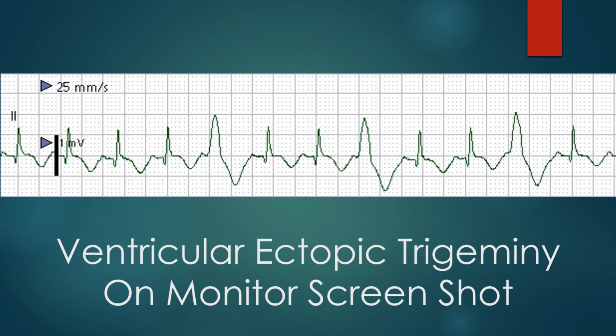Ventricular premature complexes are identified as being premature. In this case, the VPCs are not so premature, with the coupling interval from the previous sinus beat being about 400 milliseconds and that from the VPC to the subsequent sinus beat being about 560 milliseconds. Each ventricular ectopic beat is followed by a fully compensatory pause. In this case, the pauses are not very prominent because the usual heart rate itself is high and the difference between the coupling interval and the compensatory pause is small.